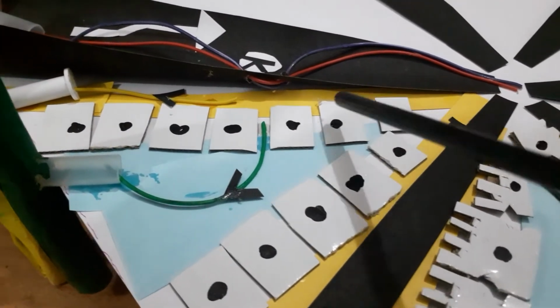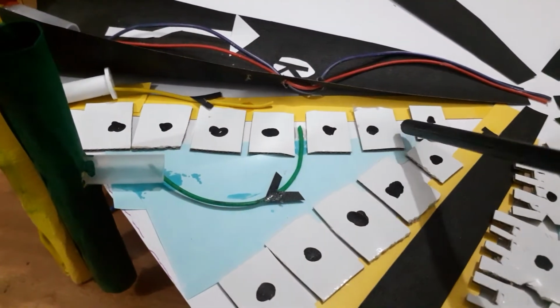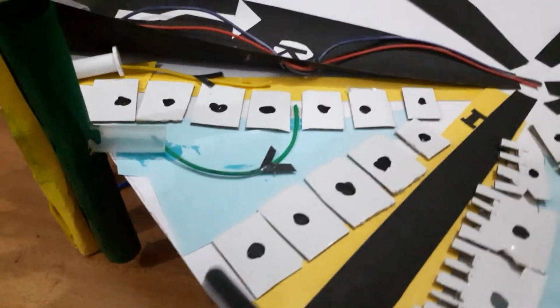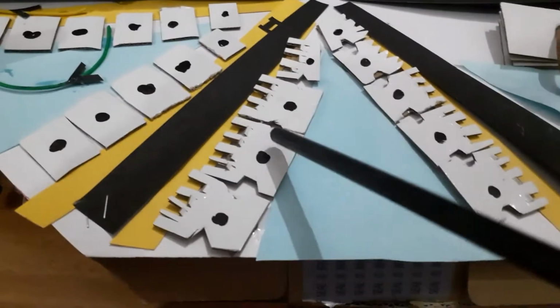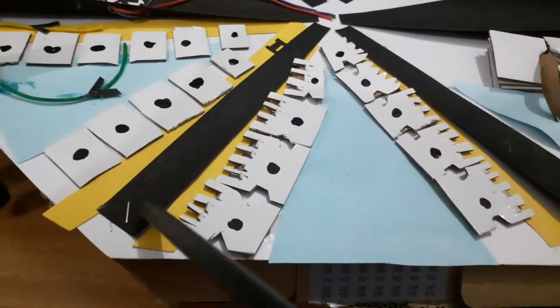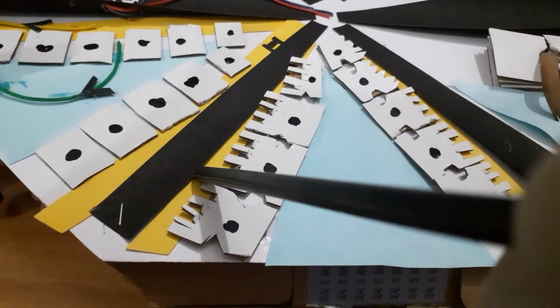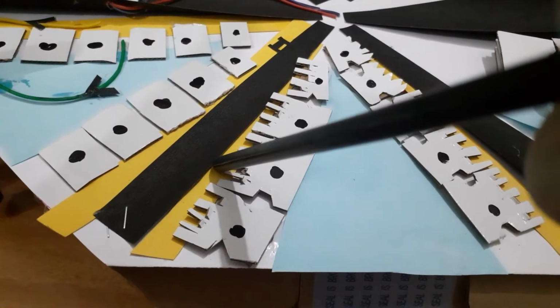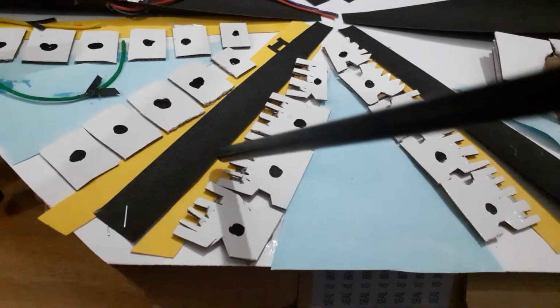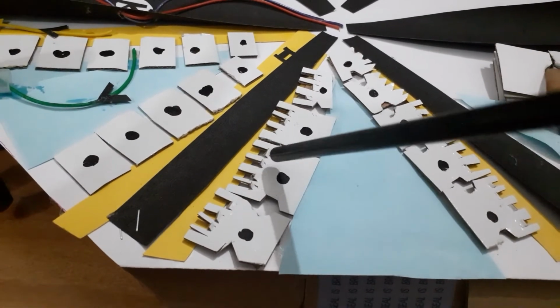And these are the plates of hepatocytes. These are hepatocyte, the liver cell. Okay, if we look at the liver cell, it has got microvilli towards the side of a space of Disse. There are microvilli. Many things are taken by the microvilli inside the liver cell.